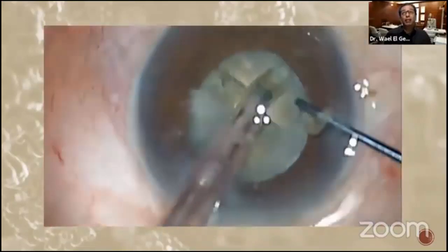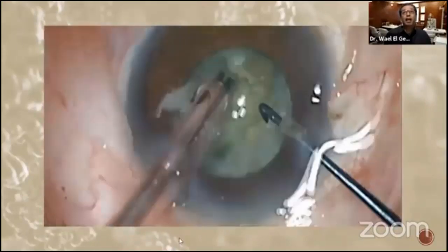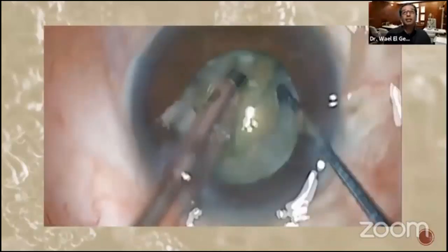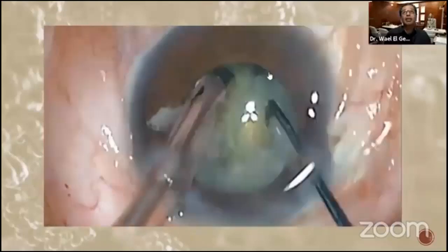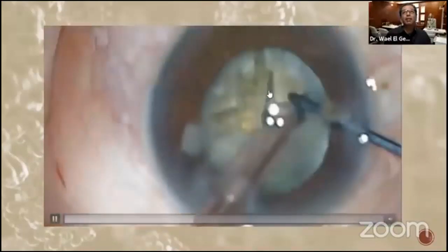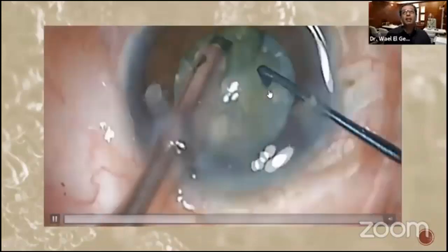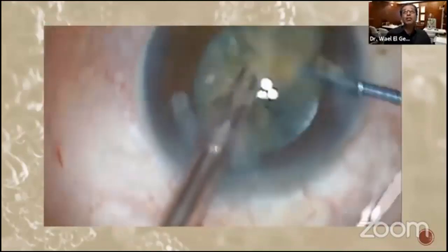It has divided, but not completely to the center, but I will go and complete my division for the other axis and make sure that my division has completed to the center and crossed the center to the other side. As you can see, the splitting of the fibers is very obvious at the periphery, and then I make sure that it comes to meet the other splitting. And here I will do the same thing, and I make sure that the fibers are splitting. Splitting the fibers is much easier than trying to break the bonds between them in the center.